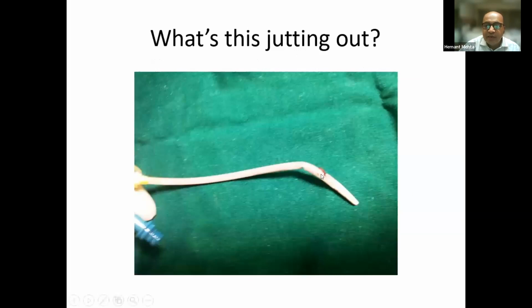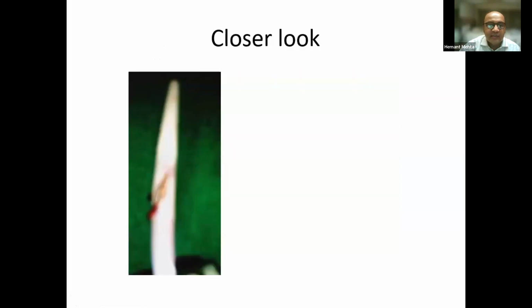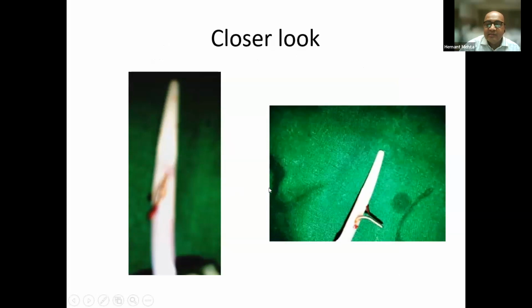and you examine it carefully, something is just jutting out. A closer look at it, you see this winding, I mean, the serrations here, if you appreciate. So now I pull it out with a forceps, and this thing is coming out from here.